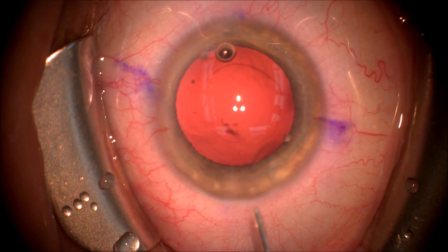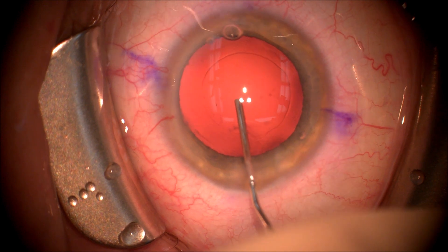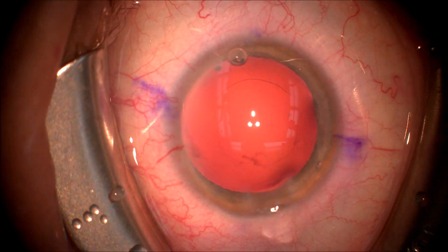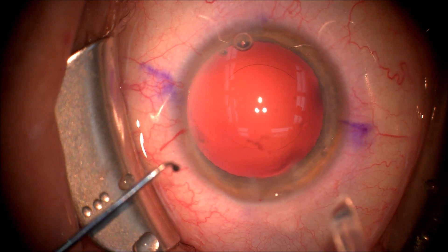We now use a 27-gauge blunt cannula to power wash the posterior capsule, removing all the small strands of cortical material that are left over. This gives us a decreased chance of posterior capsule opacification — clouding of the capsule after surgery — and a better day-one visual acuity.